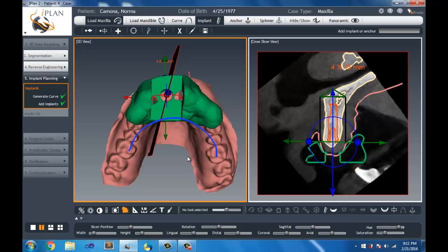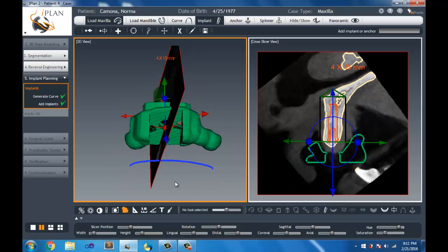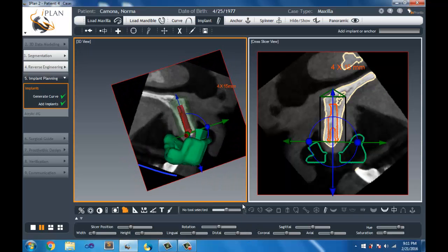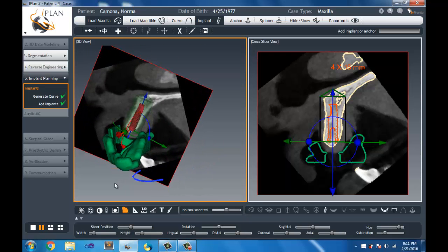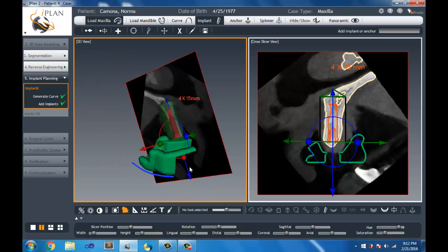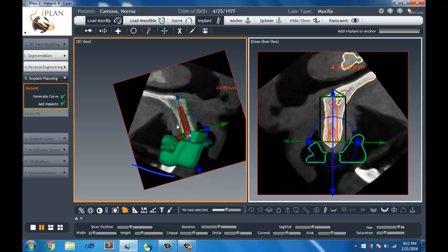Notice the tight fit of the surgical guide to the tissue and the teeth adjacent to it. It has a perfect snap, and it'll give us a perfect emergence profile for the abutment, which is the actual tissue, the pink that was just removed. Notice the red implant relevant to the bone, buccal lingually, and relevant to the surgical guide, as you can take a look and evaluate it 360 degrees.